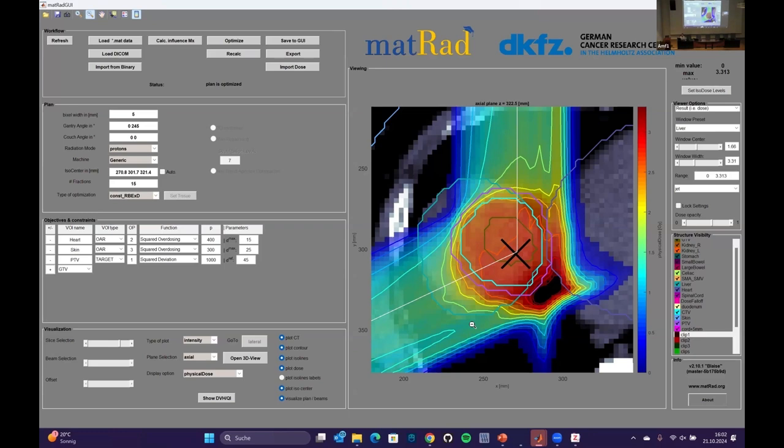But it comes from a lot of things. It's right that with the physics, we are actually quite good. If we know what's in the beam path, we know where the Bragg peak is. But the problem is, first of all, the imaging. You image with a photon scanner, like a CT. A CT is low energy X-rays, in the keV range. This gives you an attenuation factor, which you can relate to electron densities, but this does not tell you which materials are there. So you already have an inherent uncertainty due to that.